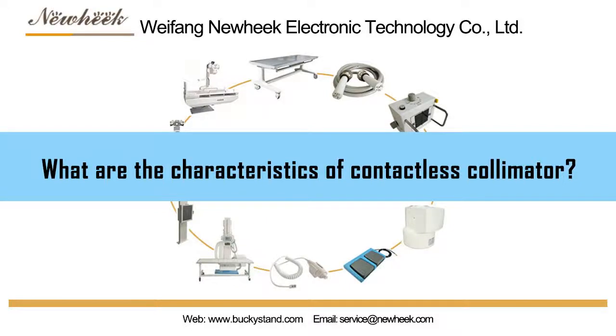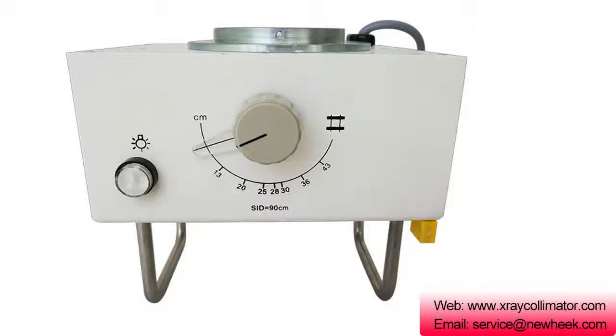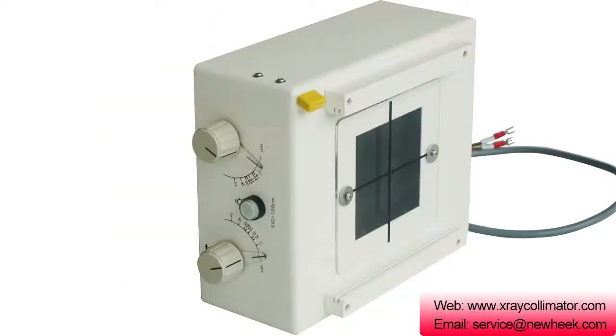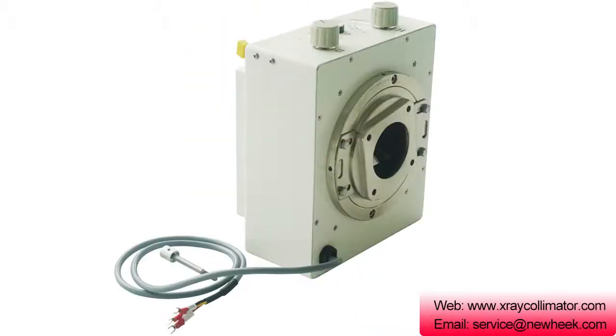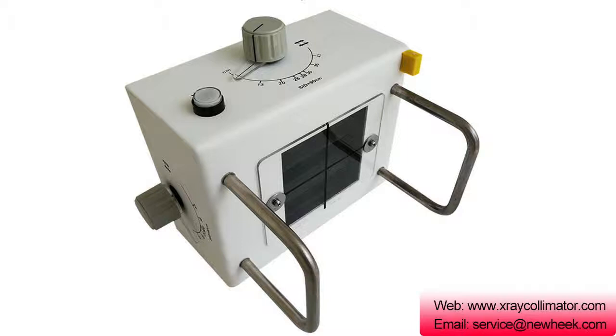The important difference between the contactless collimator and the contact collimator is that it greatly reduces the contribution of the scattered electrons in the collimator wall. Based on this, the plate collimator or the diaphragm collimator is developed. The use of composite scattering filters or scattering compensation foil measures can also ensure uniform dose distribution without the use of collimator walls to scatter electrons.